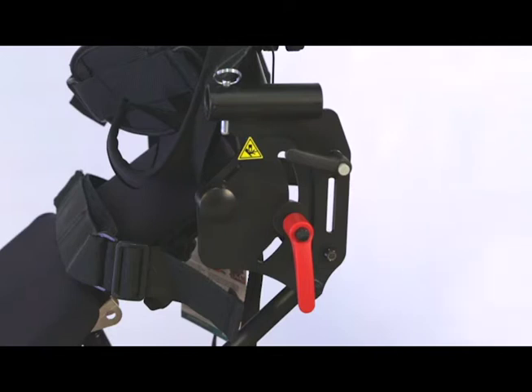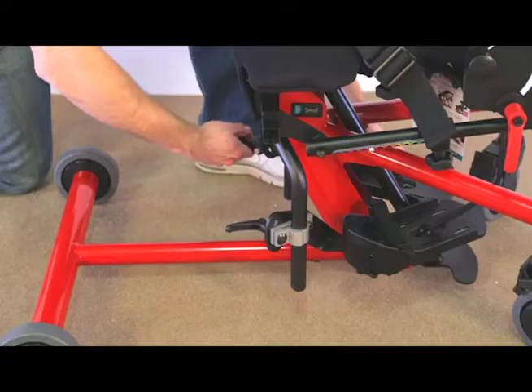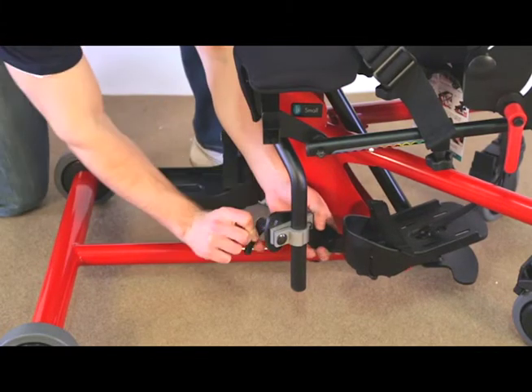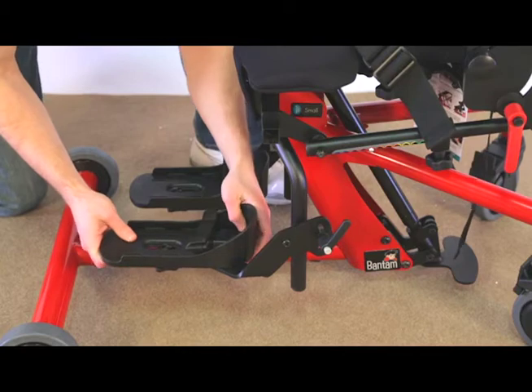Handles must be loose for use in sit-to-stand position and tightened for use in supine position. Damage may occur if the handles are not loose when returning to the sit-to-stand position. Loosen the ratchet handles on the footplate and swivel into place. Tighten securely.